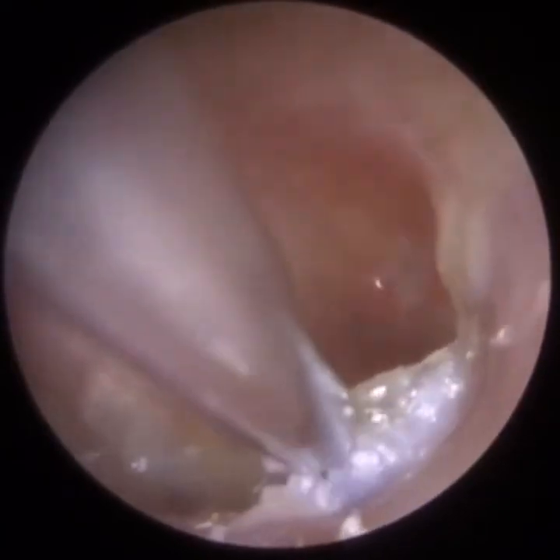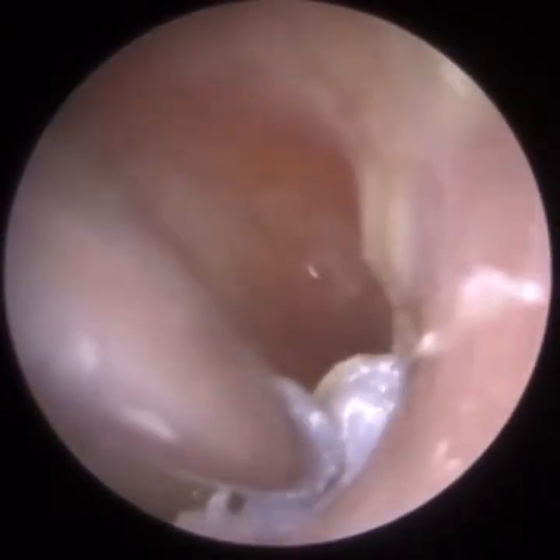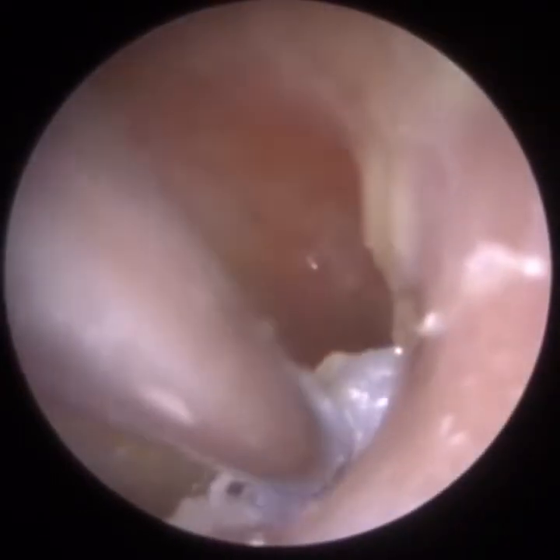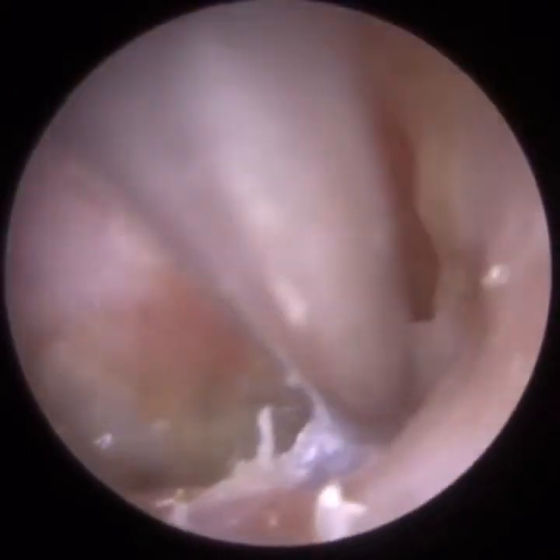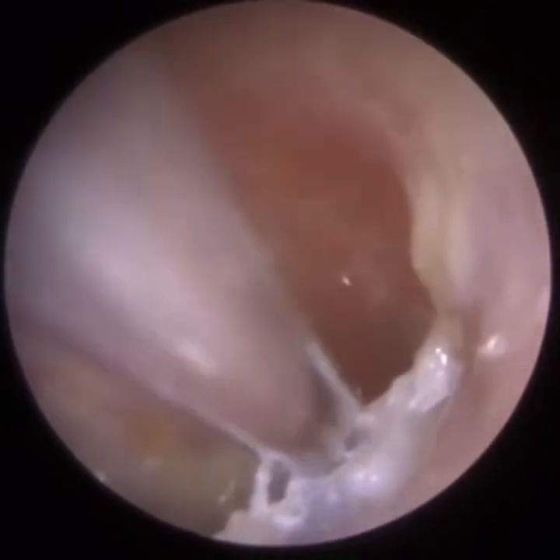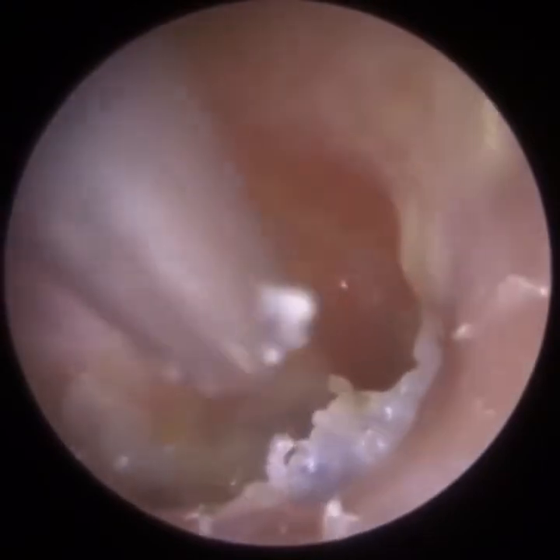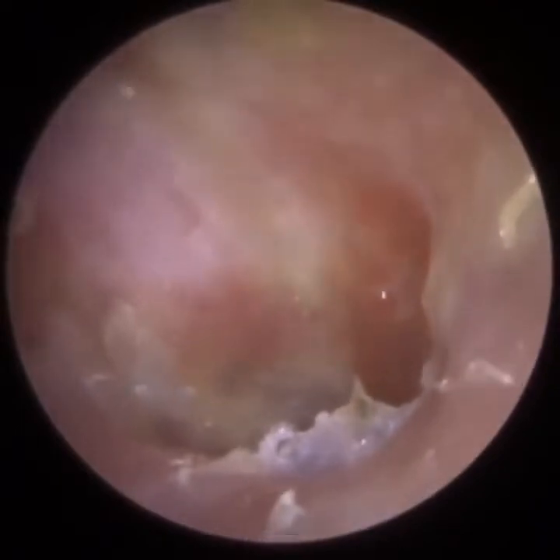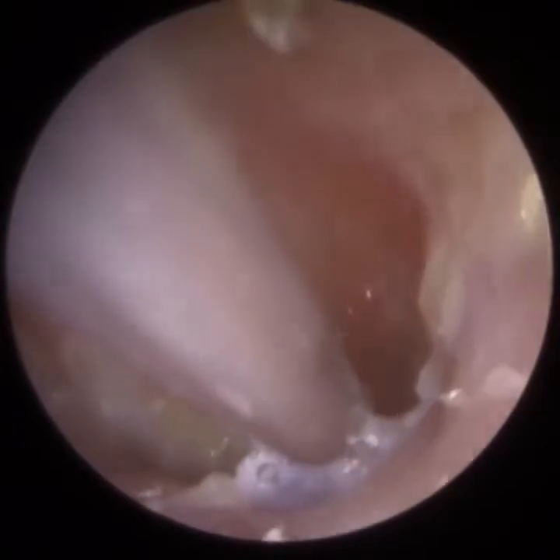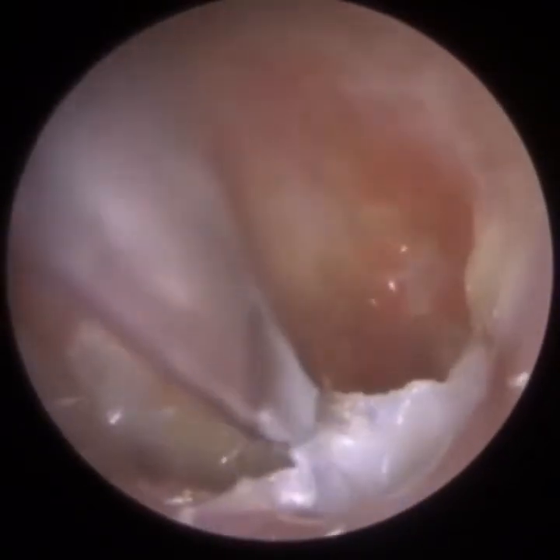This skin's lining the ear canal and it suddenly drops down in this trench. And I managed to gently peel it. And again, we're just going to be so careful. Don't want to touch the bony part of the ear canal. If I do, it's going to be really uncomfortable for the patient. It's one thing getting access, but then it's another thing removing it. We have to manoeuvre the suction probe to loosen it off the canal wall. And again, it's so difficult here in the inferior recess, and there's limited space. The patient has got quite a narrow ear canal. Unless we manage to peel this upwards.